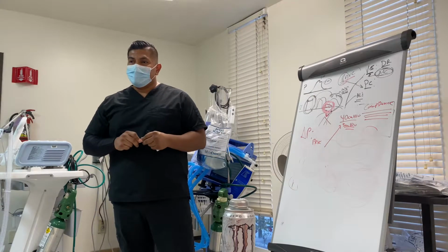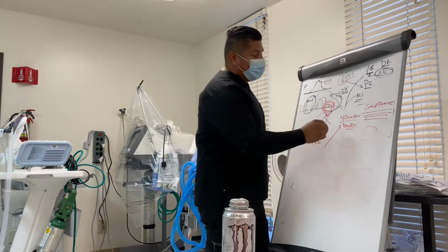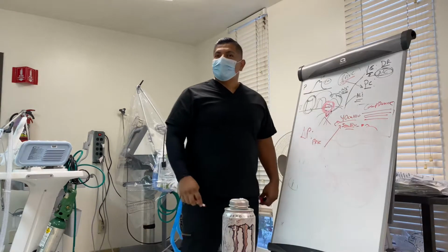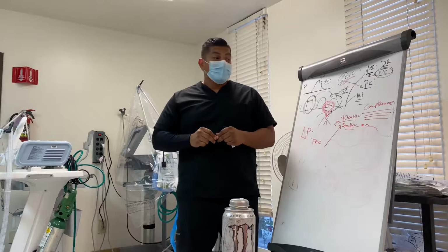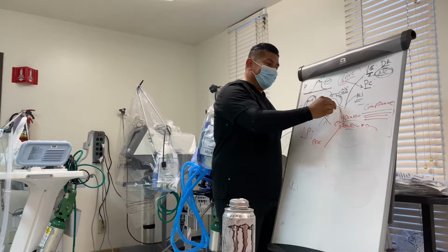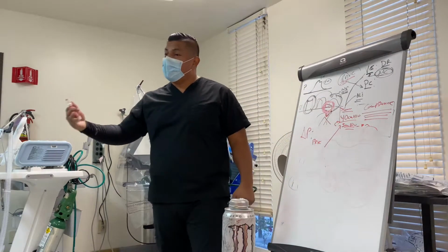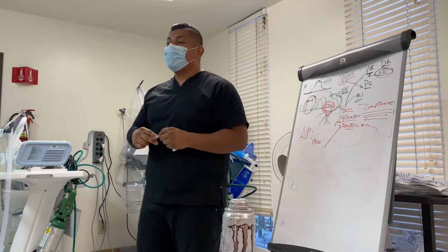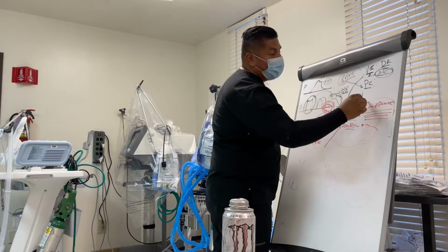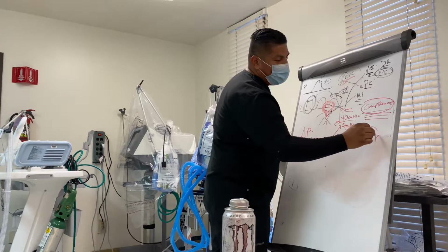Does that make sense? This is a safety mechanism. Because this is your pressure limit and this is your cutoff. Lung protection. So if you want more inspiratory pressure, what are you going to do? Increase your alarms. But notice, if you're increasing your alarms, there's something going on intrinsically with the patient. So we're going to start looking at lung compliance, your peak pressures and your plateau pressures.